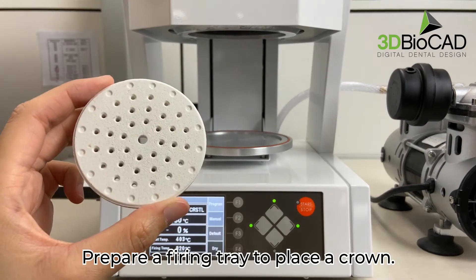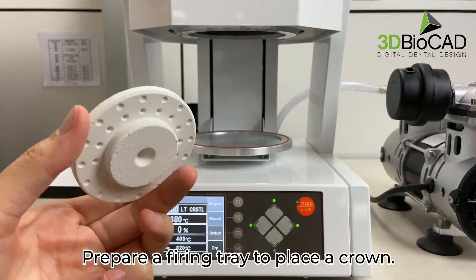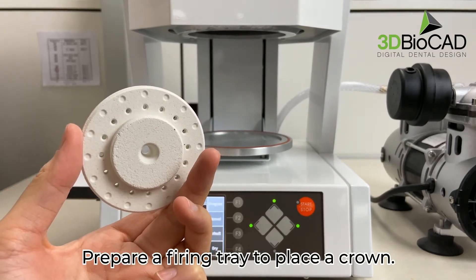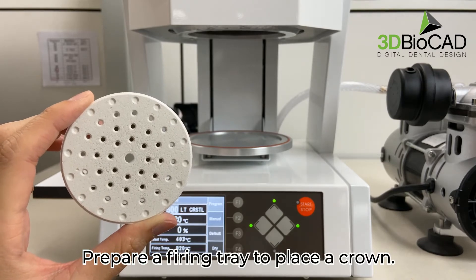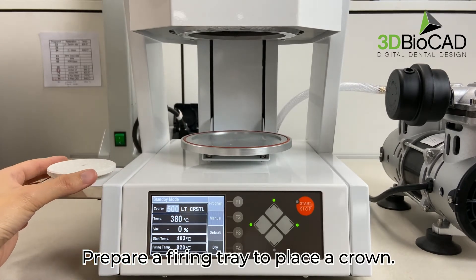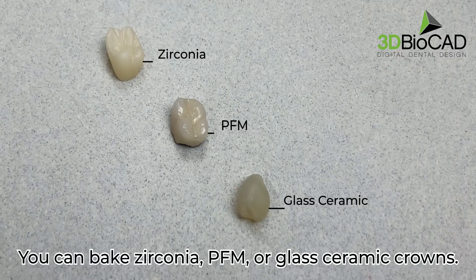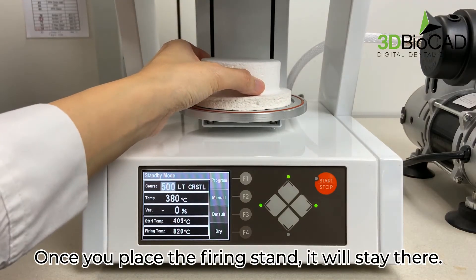Prepare a firing tray to place a crown. You can bake zirconia, PFM, or glass ceramic crowns. Once you place the firing stand, it will stay there.